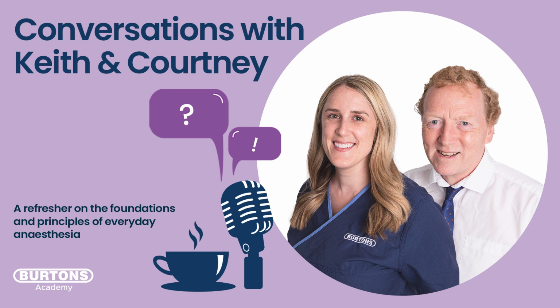And because of all the work I used to do with exotics, it's a bit of an art using a reflectance probe. But you can put it on the brachial artery for birds. You can put it on the metatarsal artery for birds. All sorts of places you can put it.